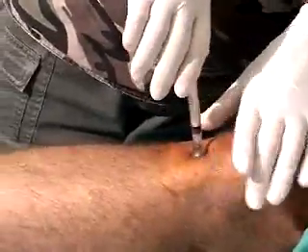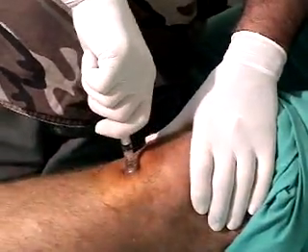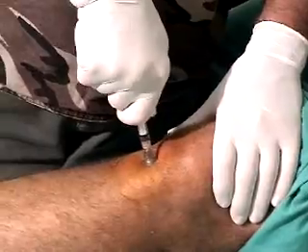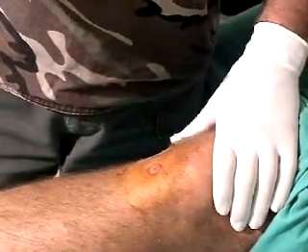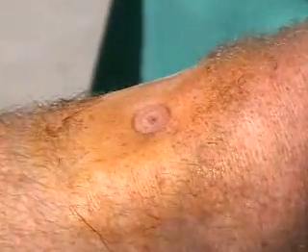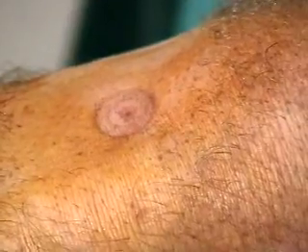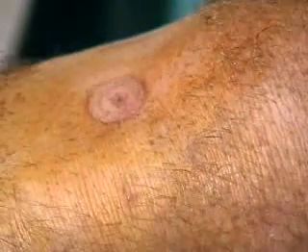We're going to use a technique of holding the leg, pulling gently upward while we twist clockwise. Do you see people are worried about how bad it's going to leak and bleed after you take it out? No. IVs do worse than that. Oh yeah, a fifteen gauge IV — can you imagine? It would be pouring out.